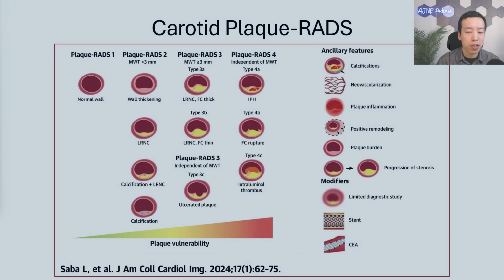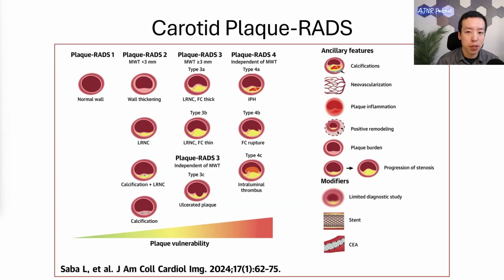How should we characterize carotid stenosis on CTA beyond stenosis grading? I'm Francis Deng, the AJNR podcast editor, and this episode highlights two papers published in the journal this past year on CTA-based Carotid Plaque-RADS. Before we get to that, let me orient you to Carotid Plaque-RADS in general.